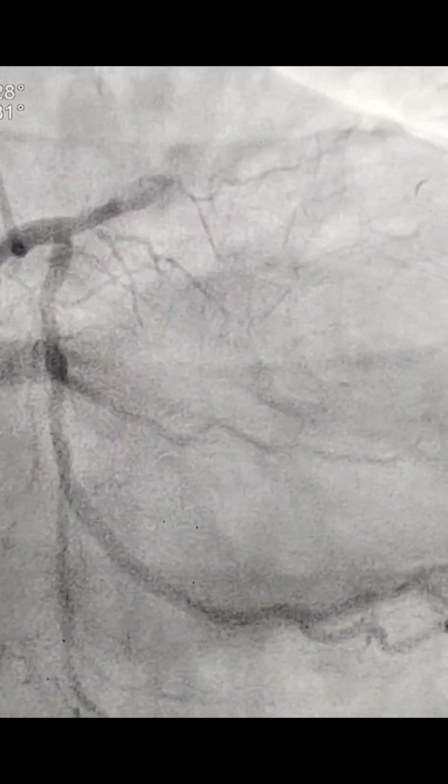So this is a 63-year-old male patient who presented with chest discomfort. There were minor changes in the ECG, and LV function was fairly normal. So this is the angio, and you can see there's a CTO in the LAD. This is the RAO caudal view, and in this view we can see there's a CTO with a tapered tip. The J-CTO score is probably a 2.